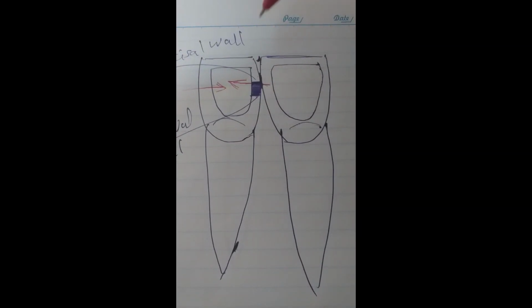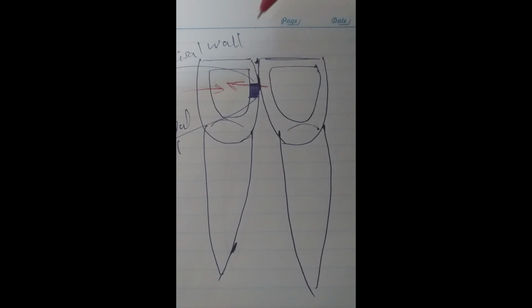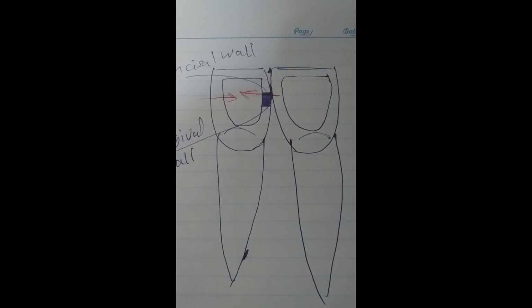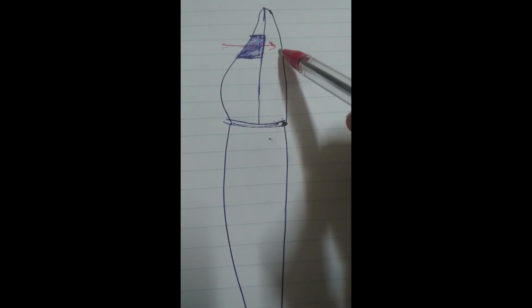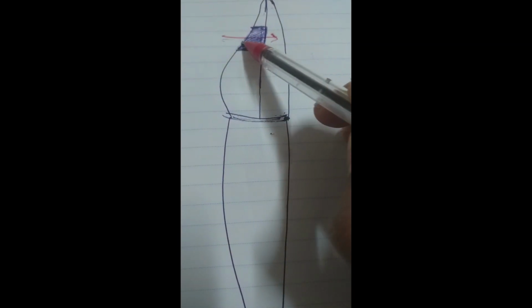In class 3 it will be 1 milli to 1.5, a number between those. Then there is something called facial depth. It goes from here to here, lingually to the facial surface, in this direction. It will be in class 3 2 millimeter.